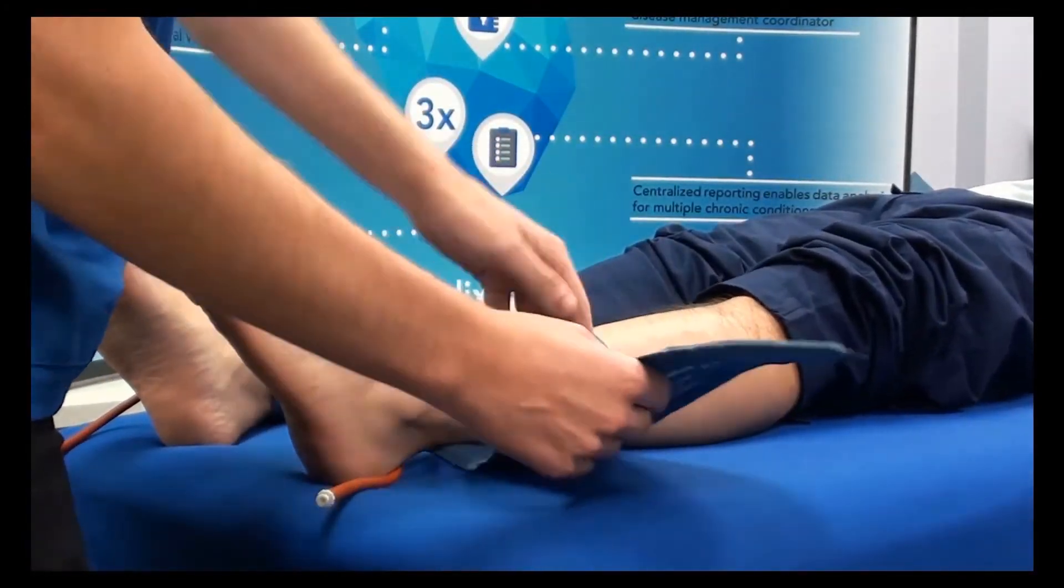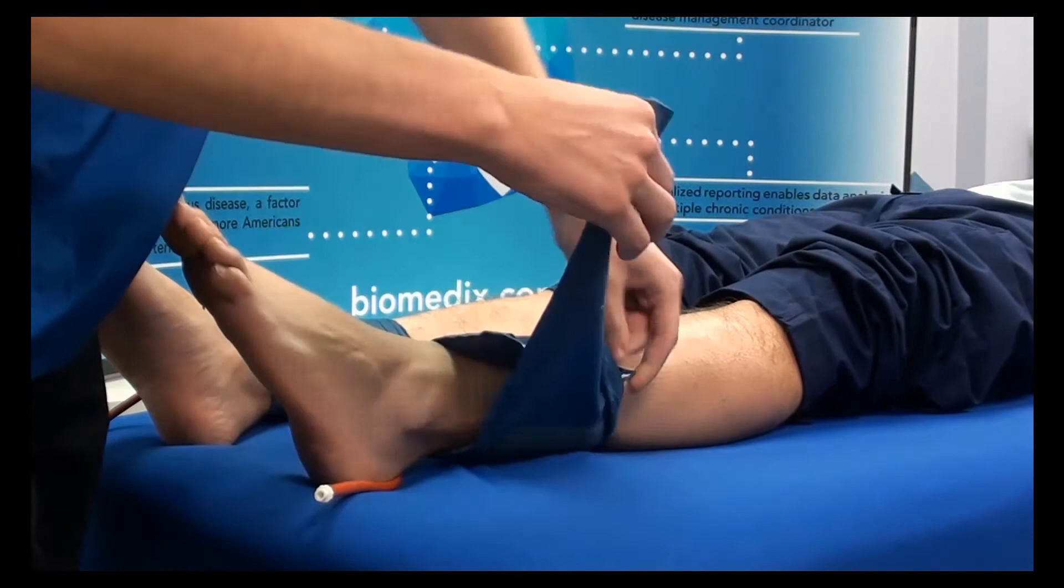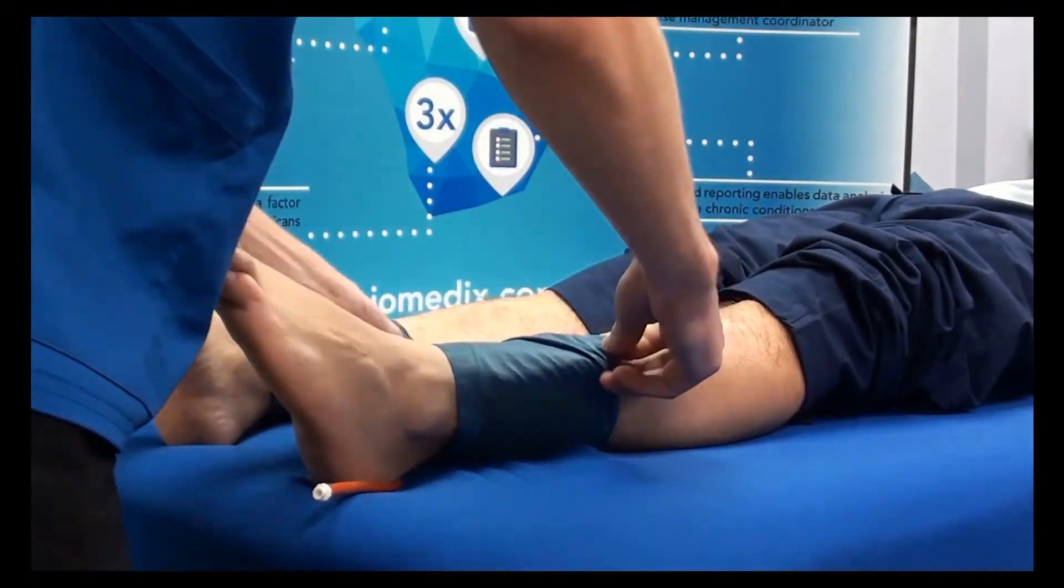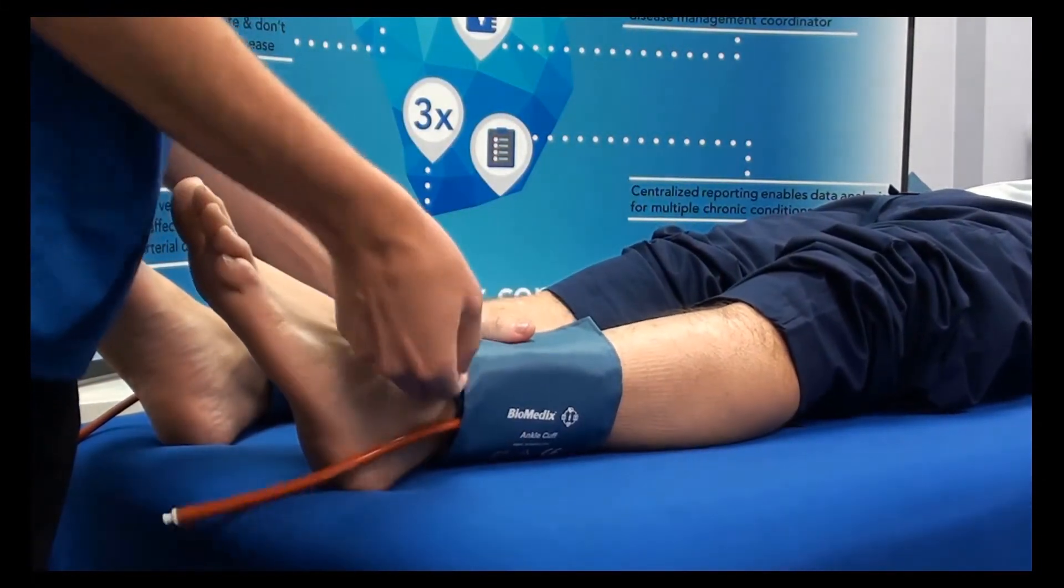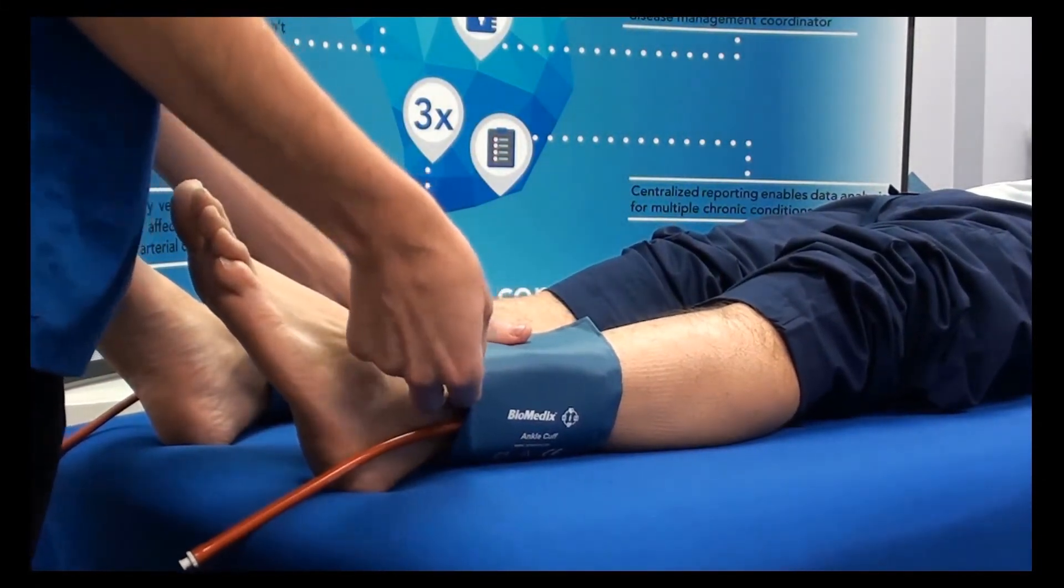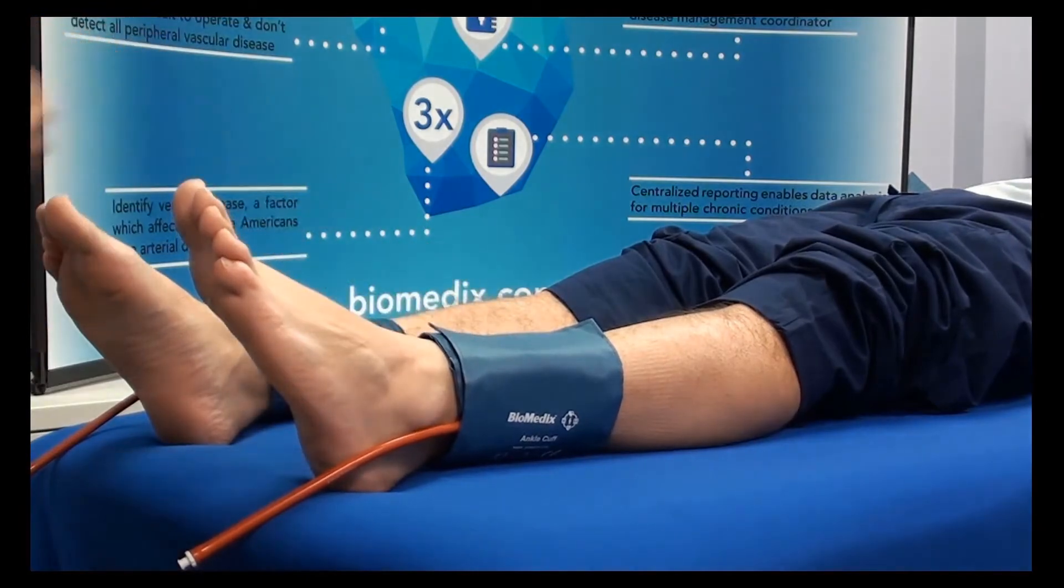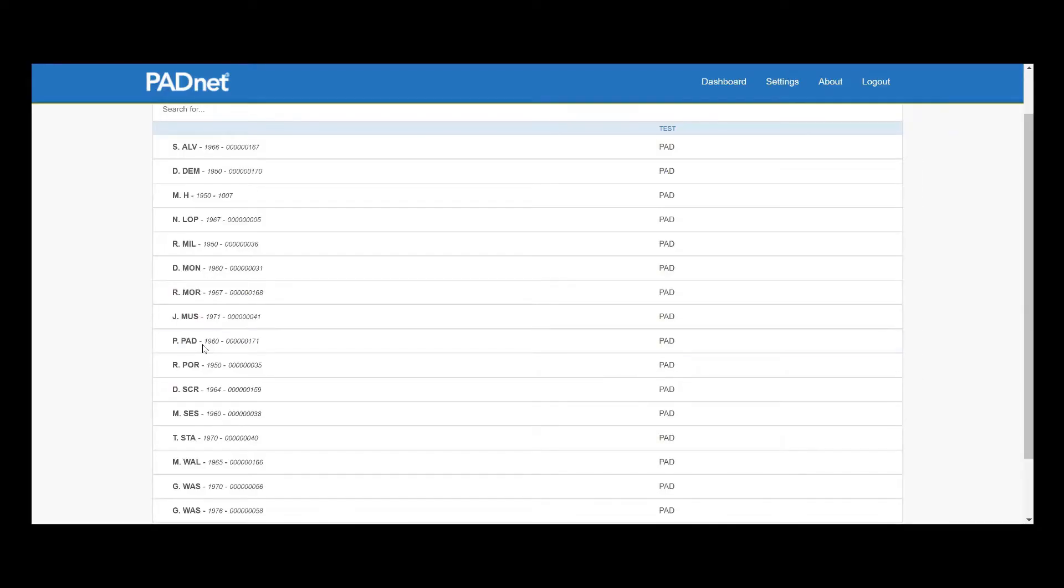We want to make sure they're on tight enough. And lastly, we want to make sure that the orange hoses are easily accessible. So we'll move those to the outside and double check the security of our cuffs.